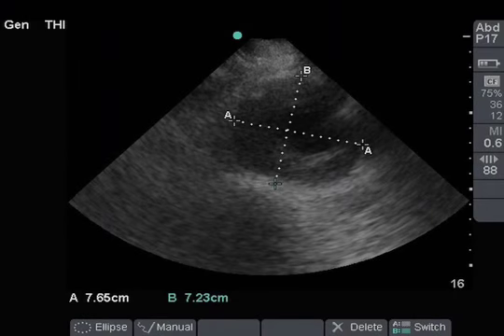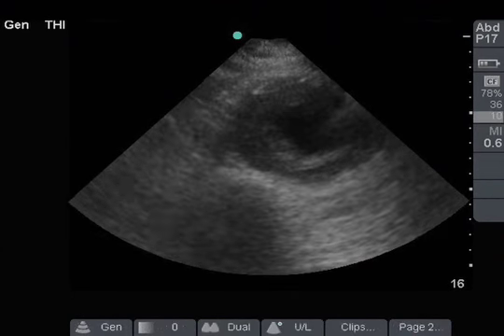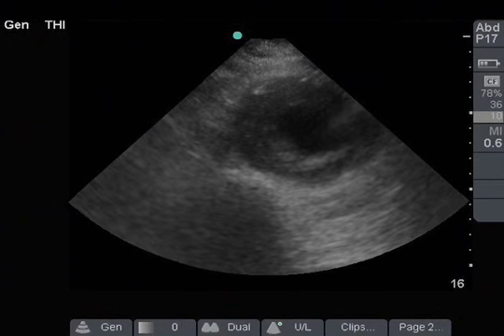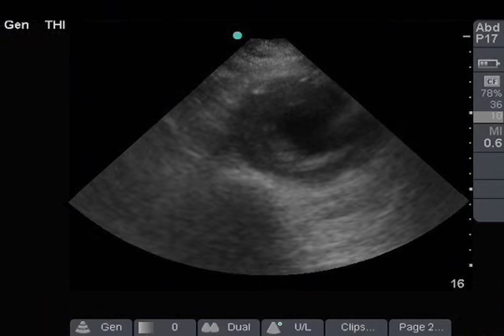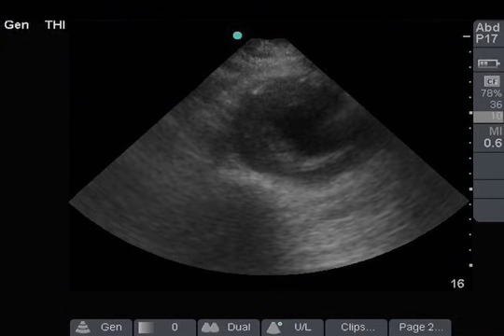In the positive exam, dilatation of the aorta beyond 3 centimeters diameter is seen. While the majority of AAAs are infrarenal and therefore identified below the SMA, it is critical to visualize the most superior portion of the abdominal aorta to obtain a complete exam.